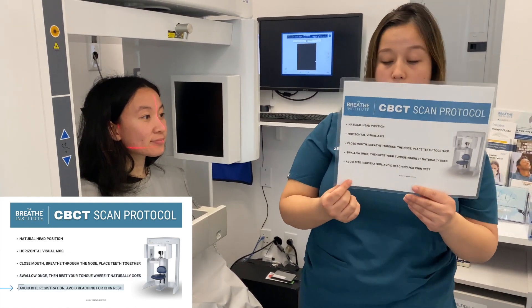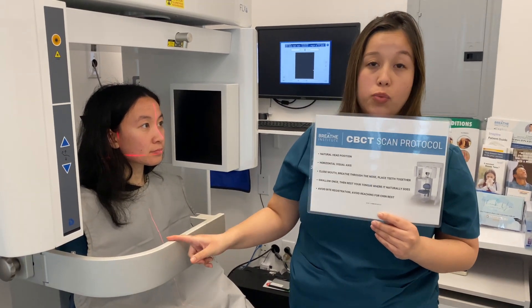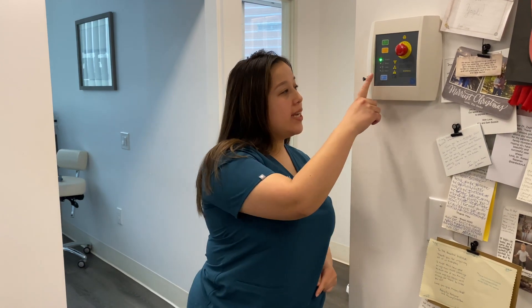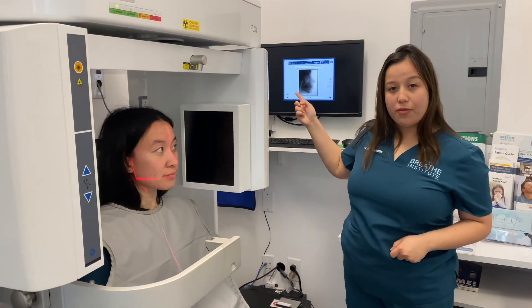Now if you have a bite registration or a chin rest, we do not want to use those for the CT scan, as that can also alter the size of the airway. Taking a preview of our patient will be helpful in identifying if we will need to reposition the patient. We have now taken a preview of the patient, Sam. We will go ahead and bring you over, and based on our preview, we can see that our protocols have been followed.